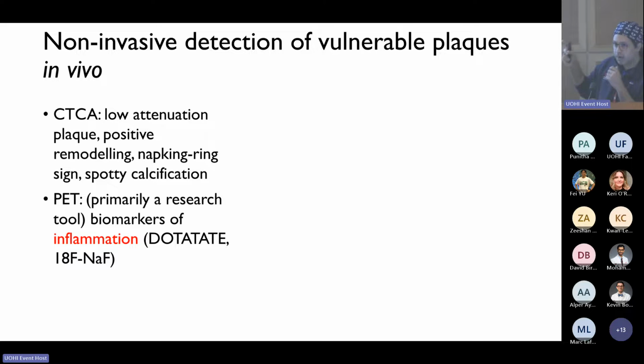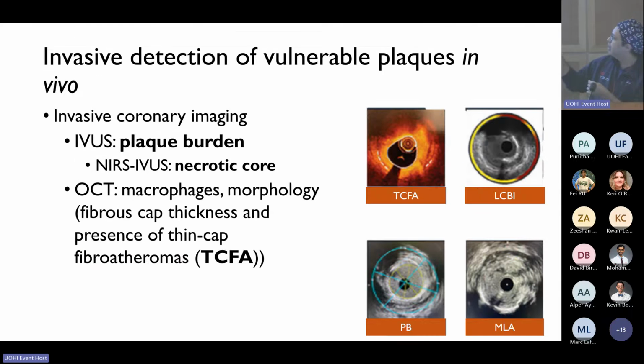So I think it's very hard to make the case at present that it can be a prognostic tool. Those studies have yet to be done and the accuracy yet to be proven. The other thing is PET has even greater than CT too big of a pixel size. So actually, a voxel size, sorry. So your accuracy diminishes even further because there's just too much coronary artery movement right now to be able to see it very clearly.